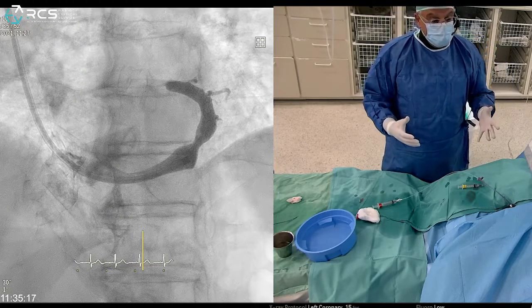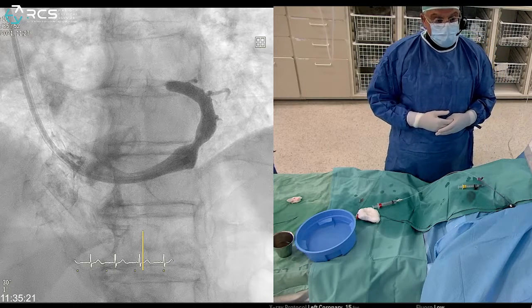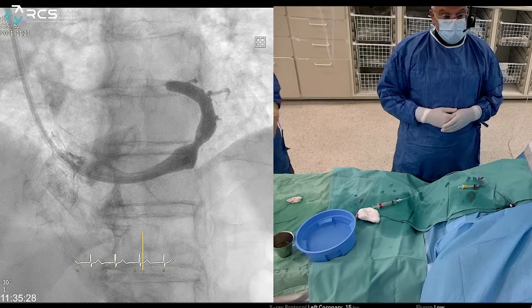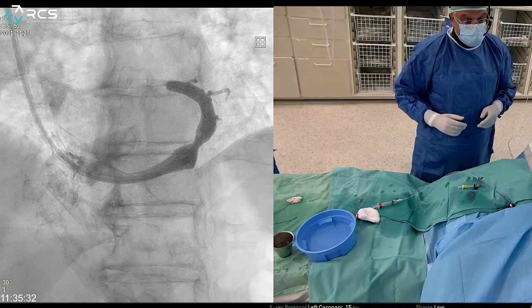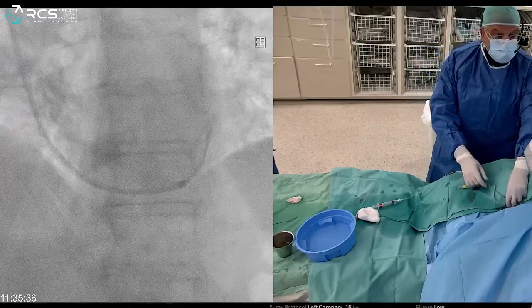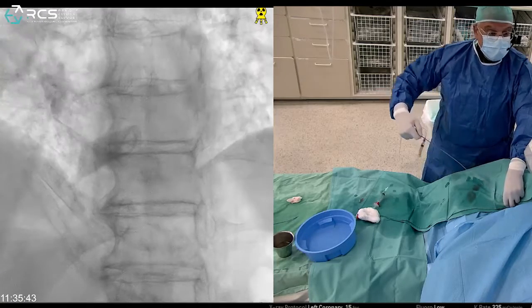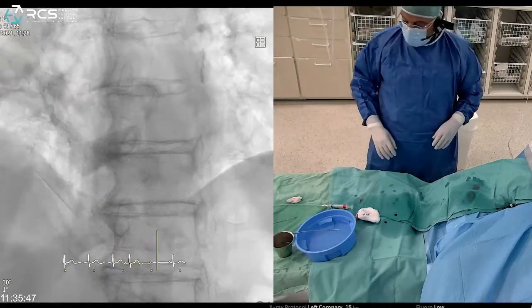The last stage is to pull back all the system under fluoroscopy and confirm the reducer is well located. We are done — that's the end of the procedure. Very nice results. Thank you, Sammy.